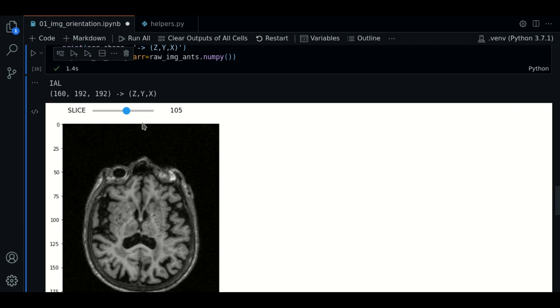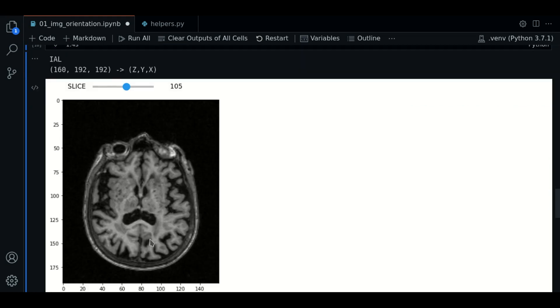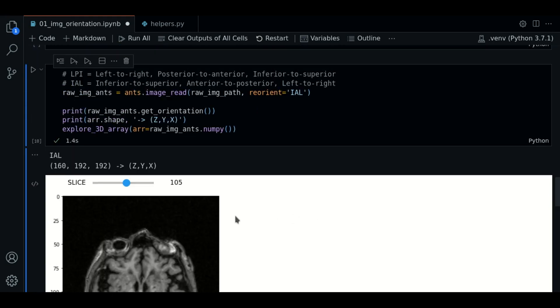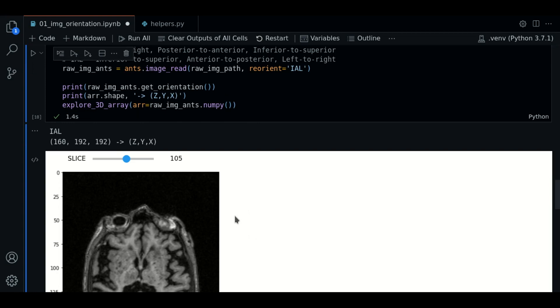In the second axis, we are going from anterior to posterior. And in the third axis, we are going from left to right of the head.